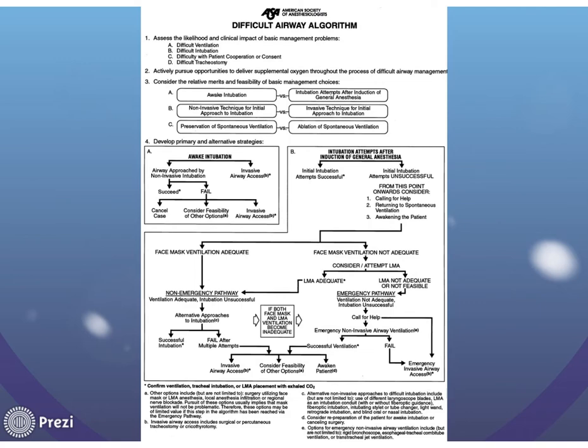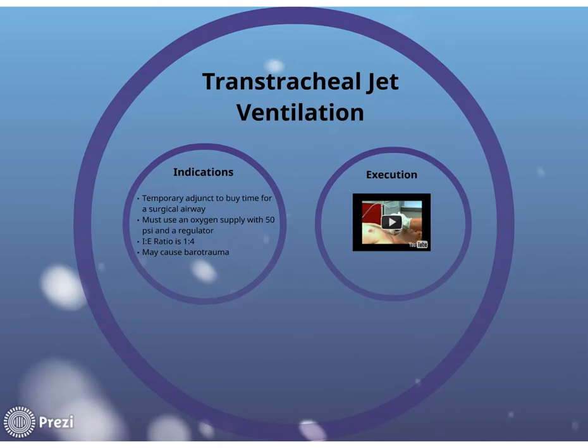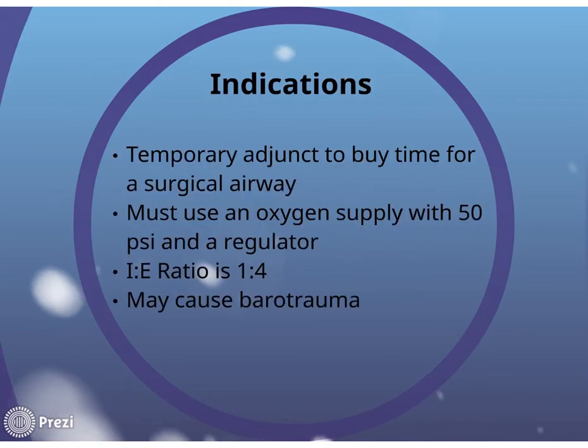It's only when we talk about the transtracheal, it's temporary. It's only temporary. It's just to keep that patient alive. And know the ratio. What does I stand for? And E, and the ratio is 1:4. And you can cause barotrauma, but you might be able to keep them alive.